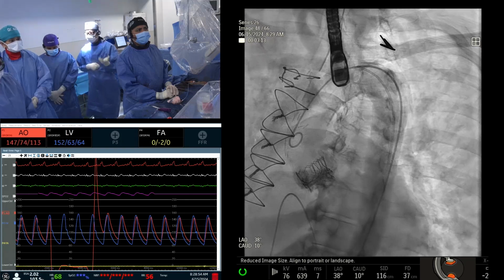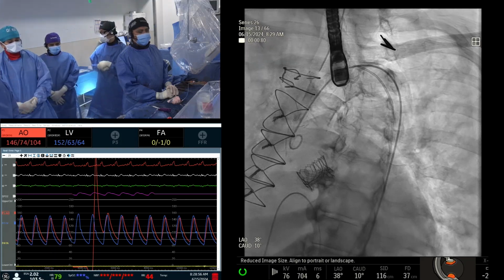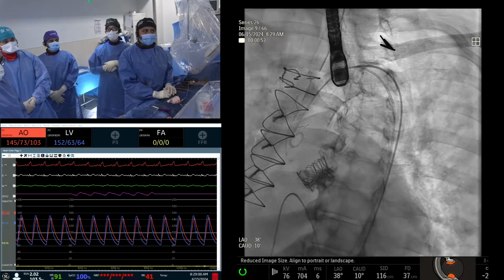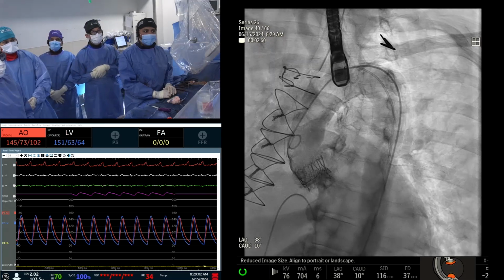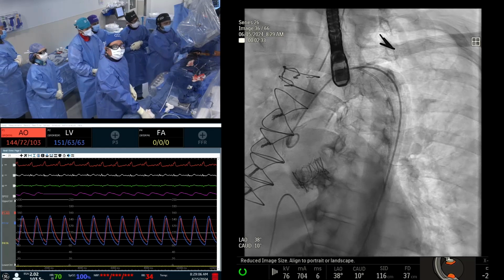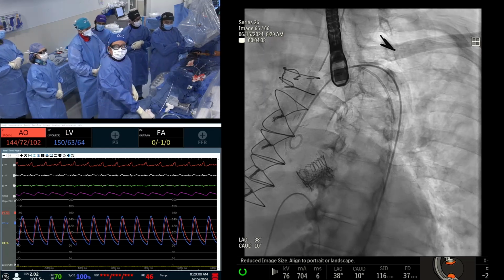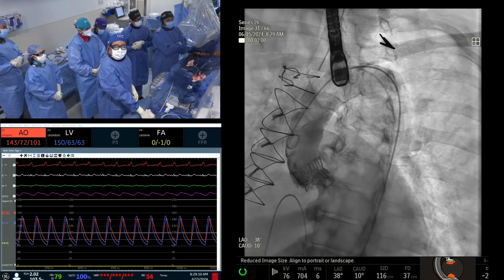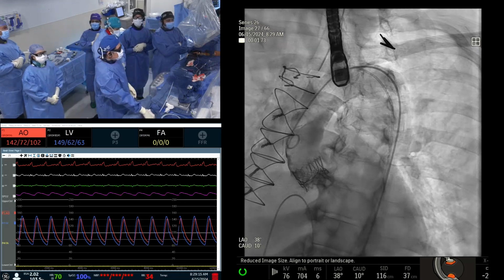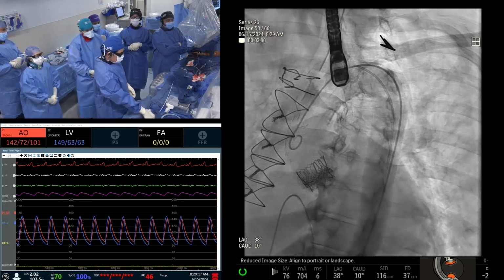And some valves are not fracturable, as you know from Dr. Vinny Bapat's app. It now gives you a recommendation on the recommended fracture balloon, so you can just go with the app. Coming back to the question of which valve to fracture: first, which are fracturable. Even among the fracturable, the data show that patients who are fractured have more complications than those who are not.